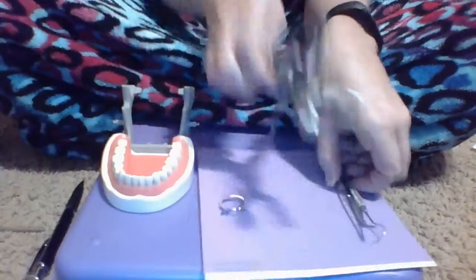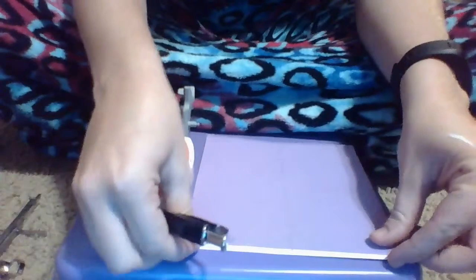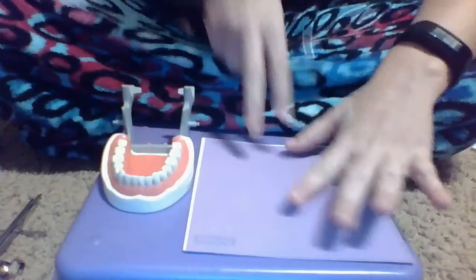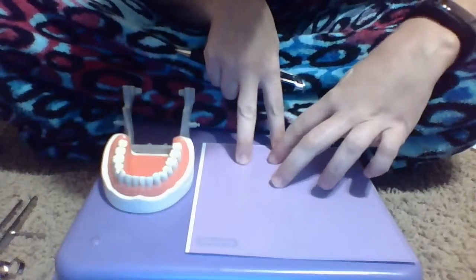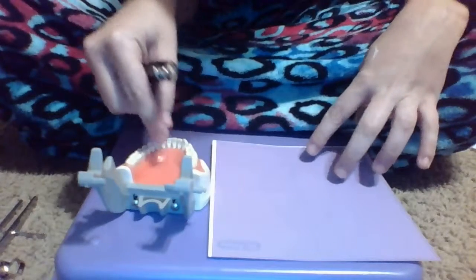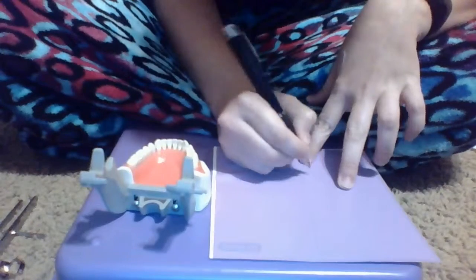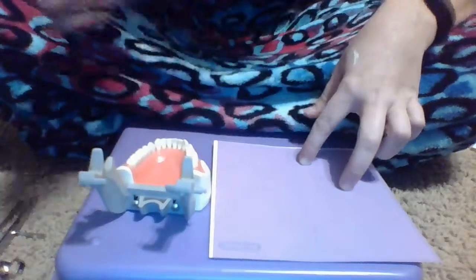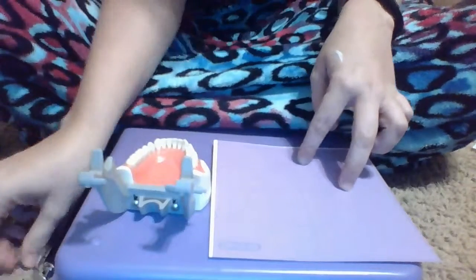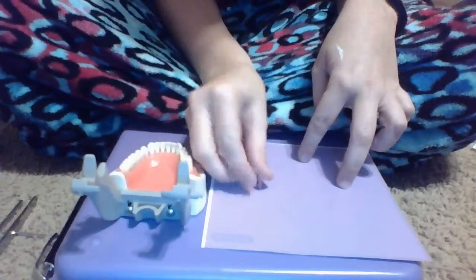Okay, so let's get started. First I am going to decide what tooth I'm going to be working on. For today's video I am going to be working on tooth number 29, so I'll mark that. I am actually going to put my clamp on the tooth behind it.